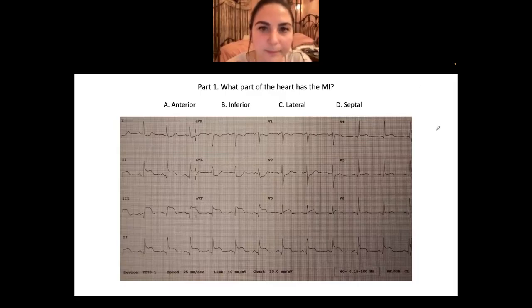All right. Sorry, these are just my questions. Not as good as Amboss. Okay, this is good. Which part of the heart is the MI?